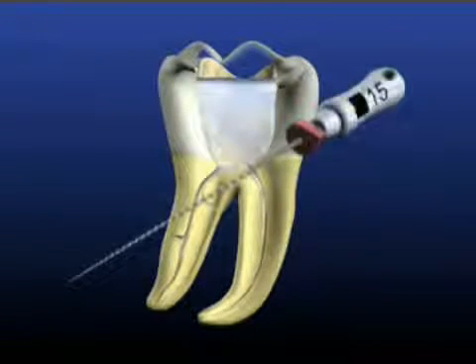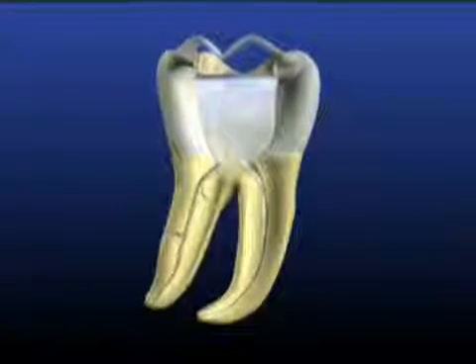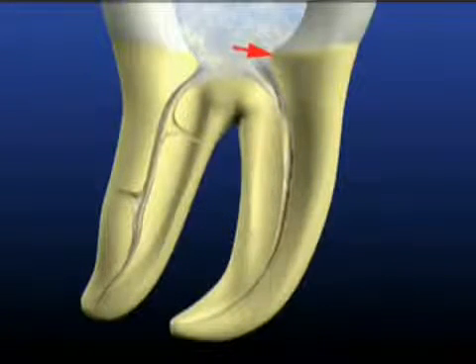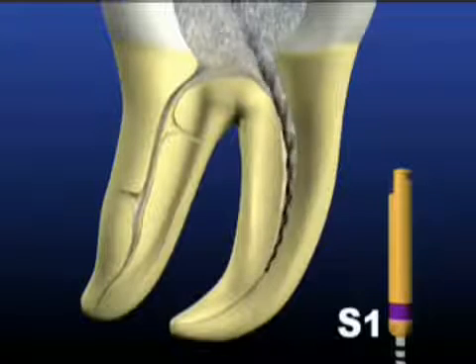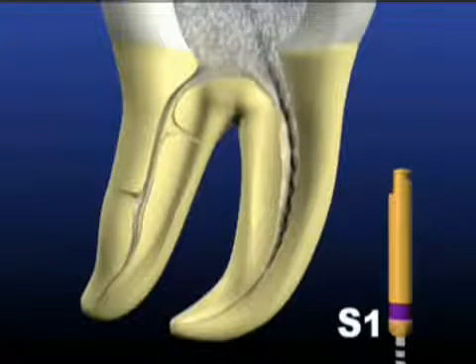Next, we use a number 15 hand file, which follows the pathway previously established by the number 10. The 15 is used carefully and delicately, exploring and slightly expanding the glide path through the coronal two-thirds of the canal. Before using the ProTapers or any rotary instrument, irrigate with sodium hypochlorite. Start the ProTaper sequence by selecting shaping file number 1, which has a purple ring on its handle. The S1 will passively follow the previously established glide path, moving apically to just short of the depth of the hand files which preceded it.